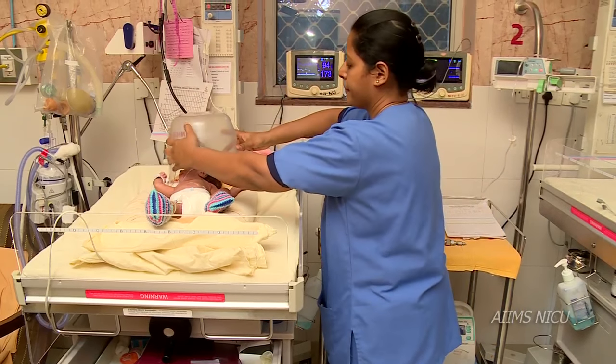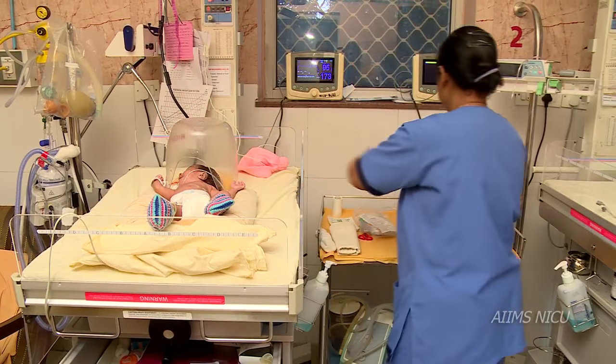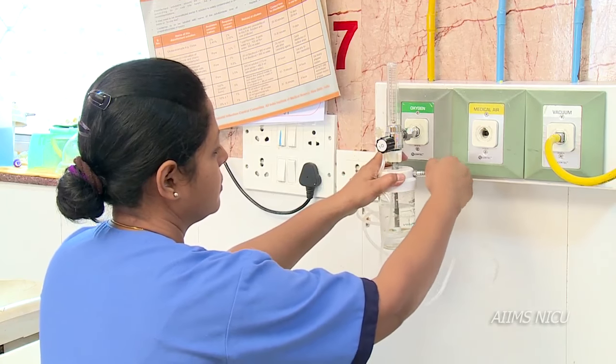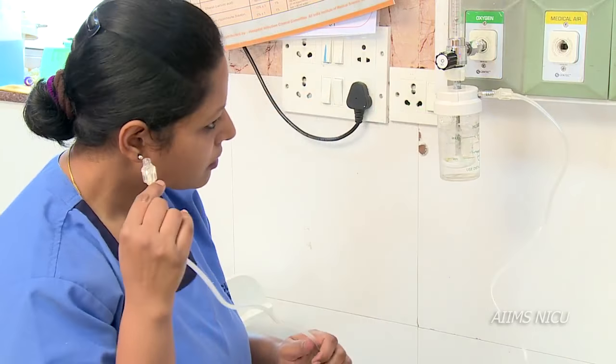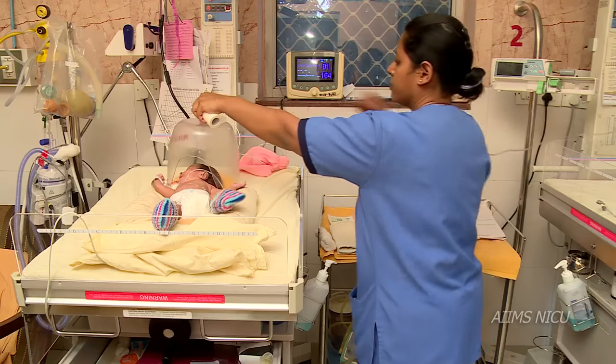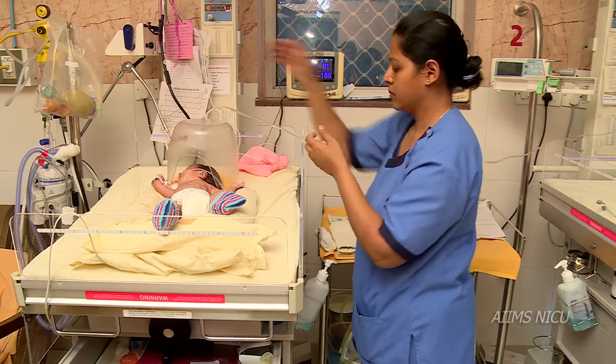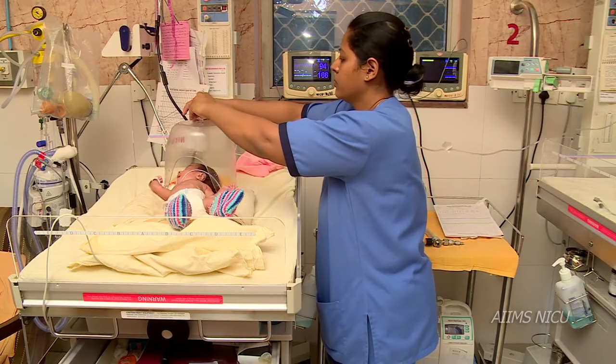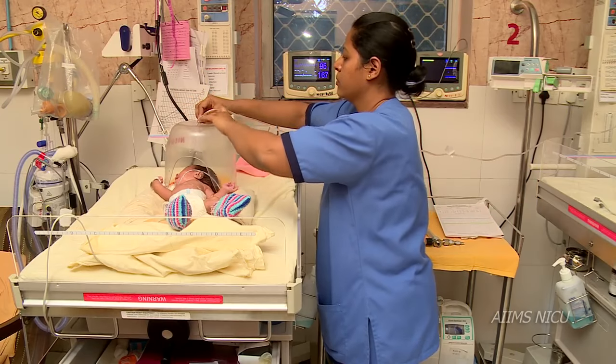Take a clean oxygen hood and put it over the newborn's head. Take a new oxygen tubing and attach one end to the flow meter and the other end to the oxygen hood. Ensure that the opening seal of the hood is at the level of the neck of the newborn.